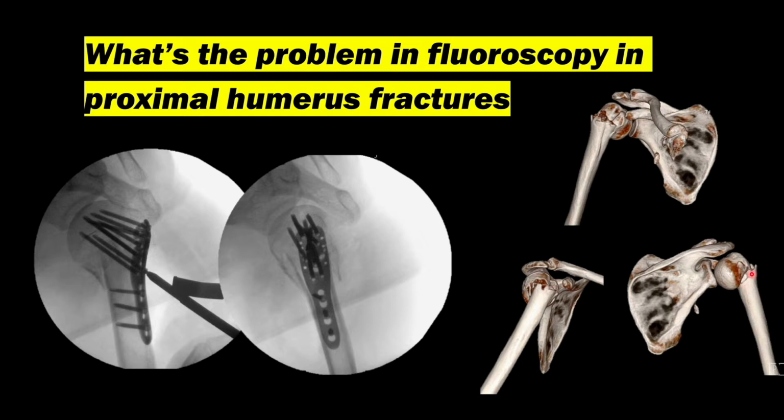But if we are planning for percutaneous fixation of this fracture using K-wires, we want fluoroscopy in such a position that we need not change the reduction maneuver. Suppose the reduction comes in abduction to control the varus, flexion to control the extension, and slight internal rotation to control the external rotation of the distal fragment. So we want the lateral view in that particular position only.